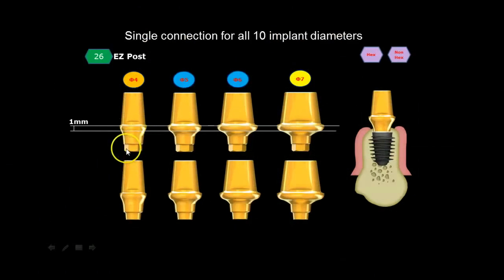One thing that I want to mention, again, because there's one prosthetic connection, there are different diameter final abutments. There's a 4mm diameter final abutment. This is mainly for your laterals, your 5.0 and 6.0, which, by the way, the circle with a little line through it means diameter. So 5.0 and 6 or more, like your medium-sized abutment. So you want to think of these as small, medium, and large. So your 5s are more for your bicuspid, canines, central incisors, so forth. So this is more laterals. And obviously the 7 is specifically for molars, dependent upon the tooth size itself.